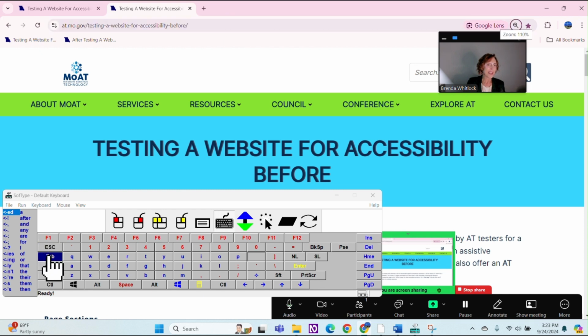I move my head around a lot, and we're going to go back to where we can tab through this. Tab, and you can follow the frame. And it's got the order. There was skip to content. We're going to the next one. And then, I decide, I actually wanted to select skip to content. But I can't do two buttons, right? I can only do one.